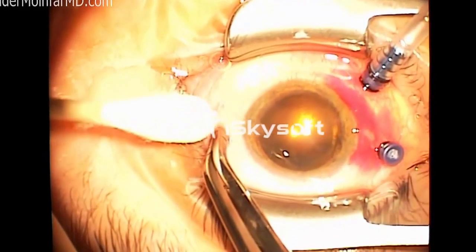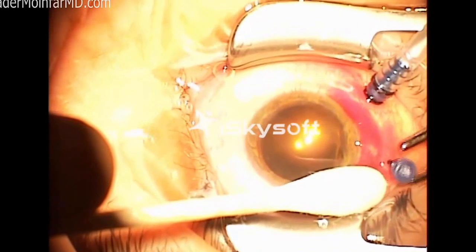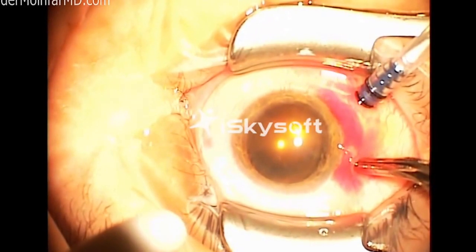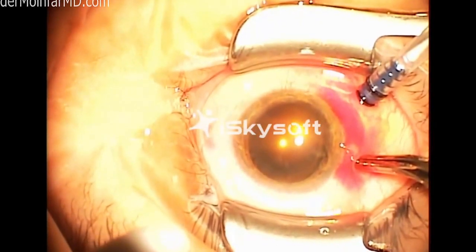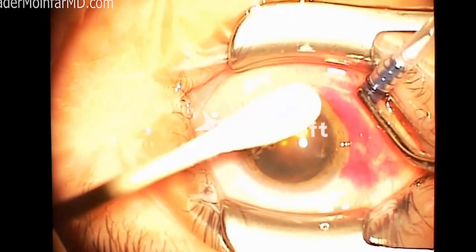And then we give some antibiotic, take off the lid speculum, which is those two metal things that you see at 12 and 6 o'clock that basically keeps the eye open. Then we take the drapes off, put some antibiotic ointment on the eye, and then we put a patch and shield on the eye, and then take the patient to the recovery room. I usually go out and talk to the family, and then I come back and talk to the patient and make sure that they're comfortable, that their vital signs are okay. If they're diabetic, we recheck the sugar. And then I always call the patients, or have somebody from my office call the patient later that evening to make sure that everything is stable before they go to bed, and make sure that there are no issues that we have to address.